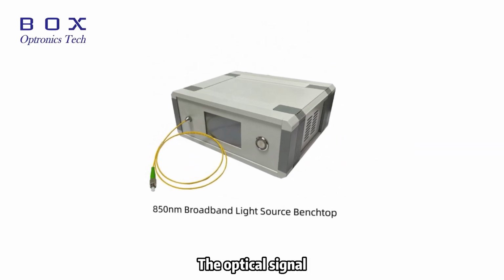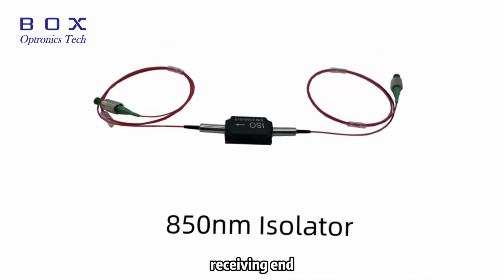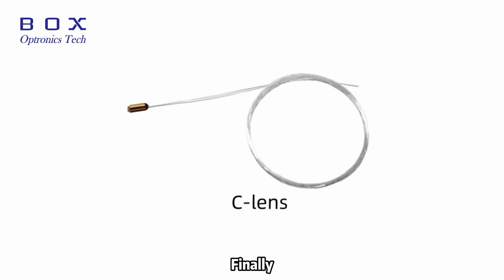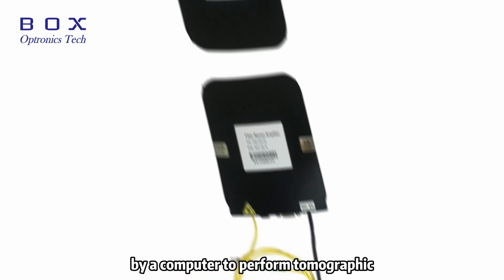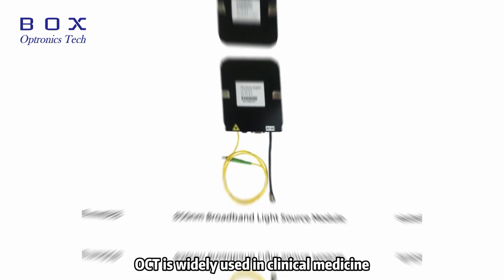The optical signal is converted into an electrical signal through a photodetector at the receiving end, which is then collected by a data acquisition card. Finally, the signal is processed and reconstructed by a computer to perform tomographic imaging of the sample. OCT is widely used in clinical medicine.